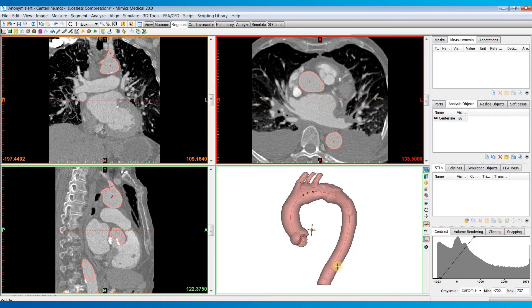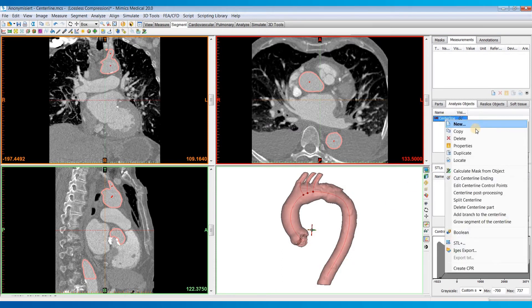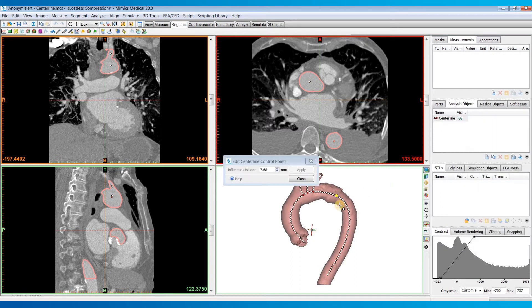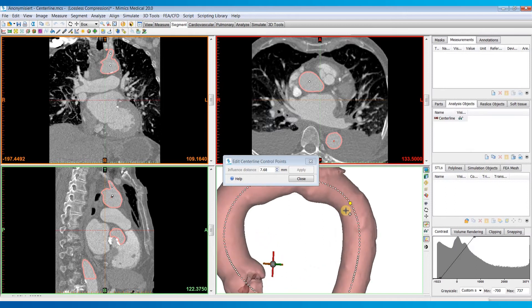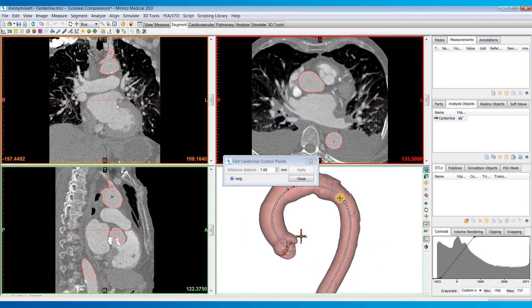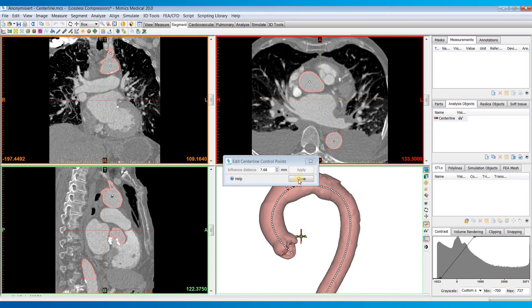Now once it's calculated, you can do some advanced operations on it by right-clicking on it. And there's a number of different options you can have. So if you wanted to edit those centerline control points that were calculated, you can see them all here. You could click on one of these and drag them around. But most of the time, you're just going to want to keep them in their optimal position.